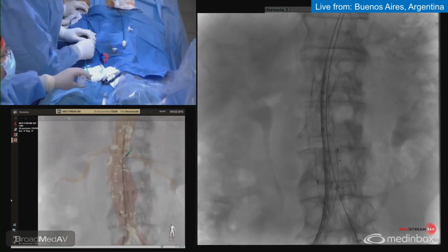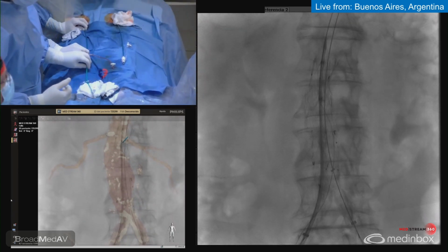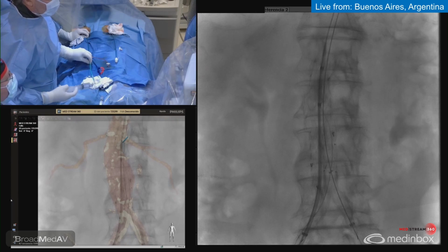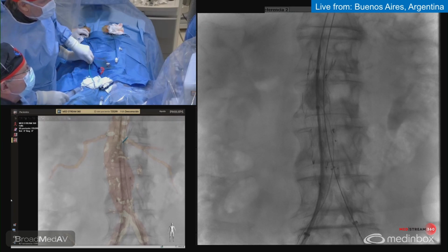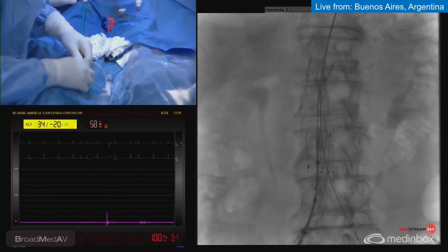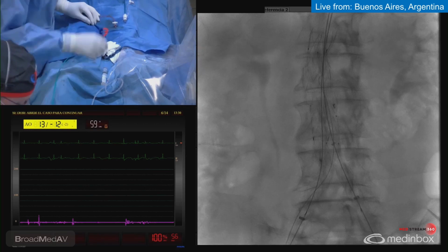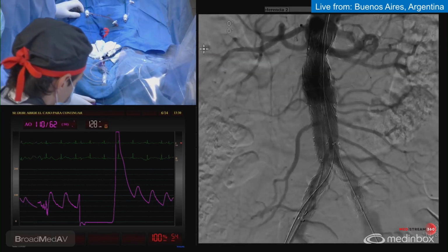I'm going up. I'm going to inflate here on the proximal neck. Okay, no, just trying to see the rectangular configuration is more than enough. You don't post dilate. No, it's just to, how to say, remodeling. Remodeling. Yes, this is the word. So you see that it's conical. We bet that you have a perfect sealing on the proximal edge. Here, where it was the stenosis, if we have resistance there, we can go with the non-compliant balloon. So I'm going to inflate there because if we still have a stenosis there, we also can deploy the stent. We still have some leakage there, but not so important.